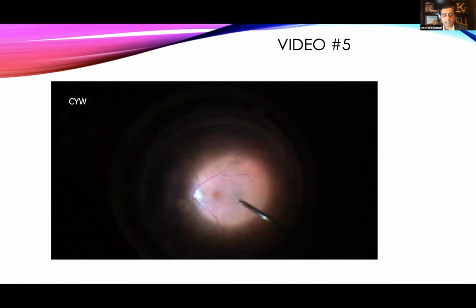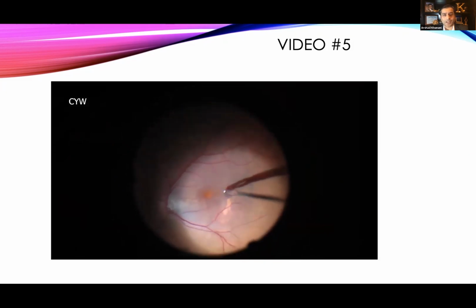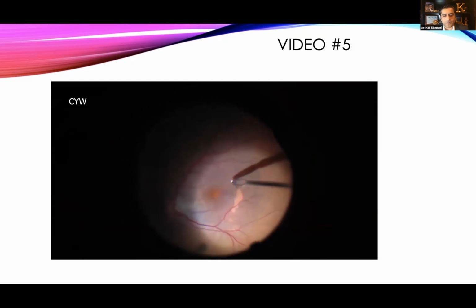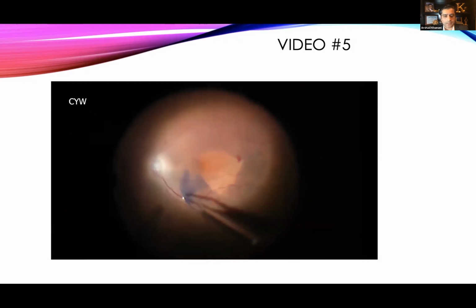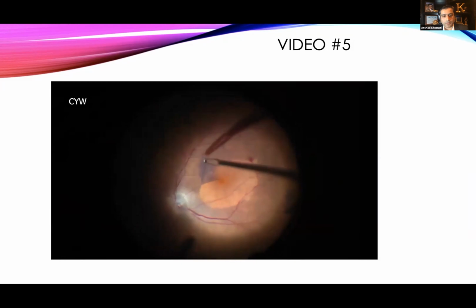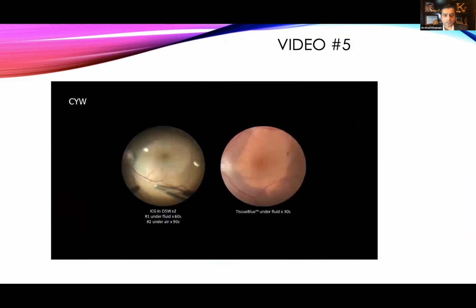And then what I like in a macular hole case is that I don't have to worry about ICG going into the hole, and those crystals not dissolving and trying to cause toxicity. So I think safety is crucial here, and she does a nice flap, and you can see this is a relatively blonde, light fundus, and you can see the really good stain. So this is key here.